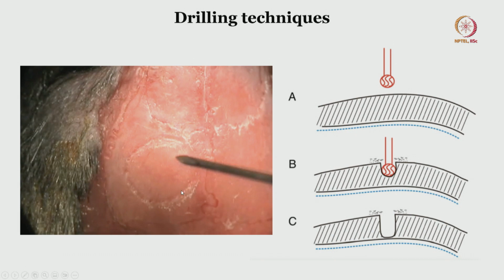That's the standard procedure in humans, wherein a burr hole is made and then there is a cutter with a foot plate which goes all around and cuts it. Because the skull is so thin, it is sensible to thin it out further with the drill and then separate it from the surrounding skull.